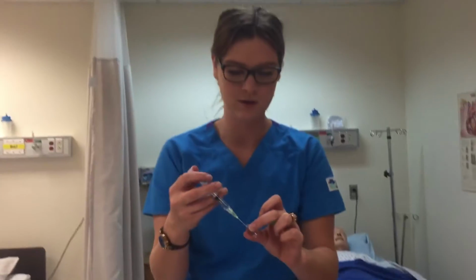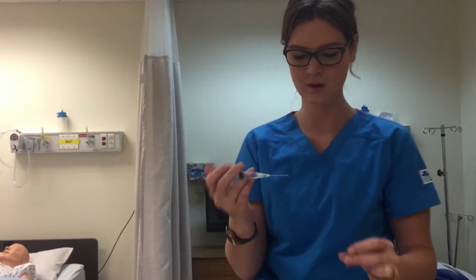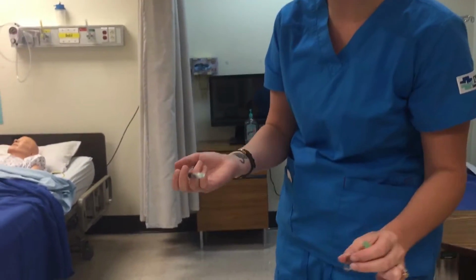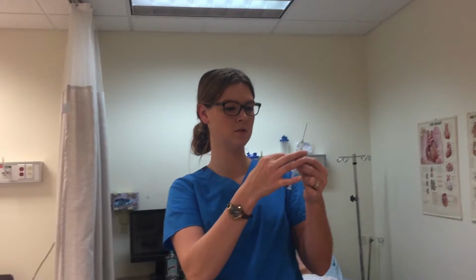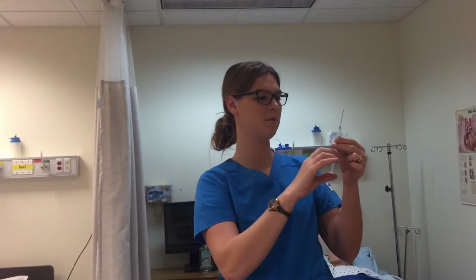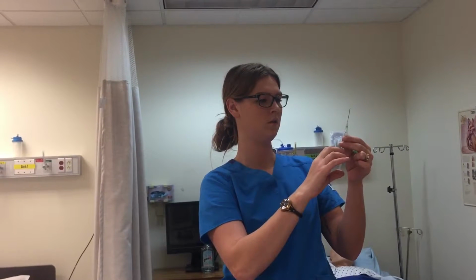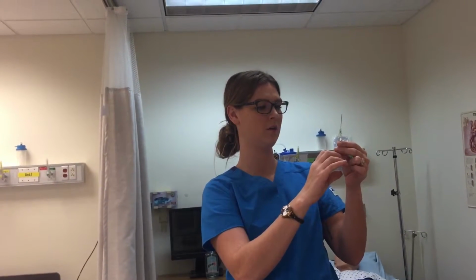And I might have to kind of angle it to get every last drop. Okay, so now this is empty. I'm going to dispose of this in the sharps container. I'm going to push up the air bubbles. Okay, the air bubbles are up. Push out all the extra air, which I got quite a bit of air.